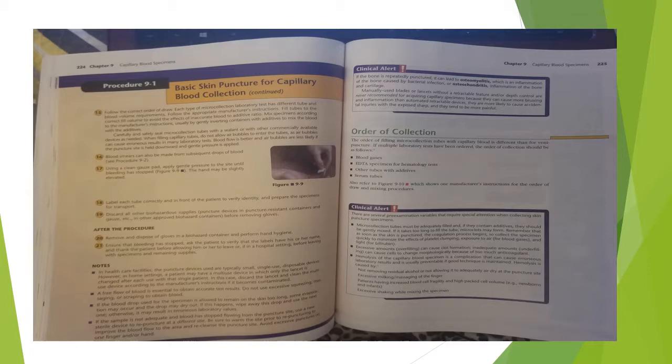Hemolysis of the capillary blood specimen is a complication that can cause erroneous laboratory results and is usually preventable if good technique is maintained. Hemolysis is caused by not removing residual alcohol or not allowing it to adequately air dry at the puncture site, excessive milking or massaging of the finger, patients who have increased blood cell fragility and high packed cell volume, such as newborns and infants, and excessive shaking while mixing the specimen.